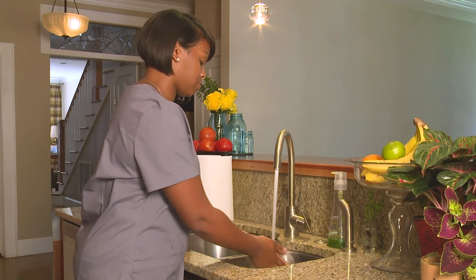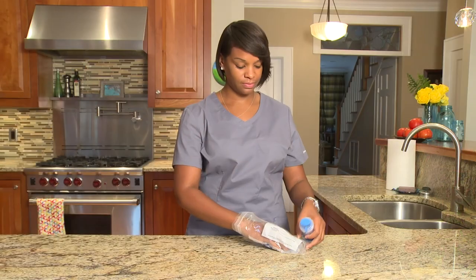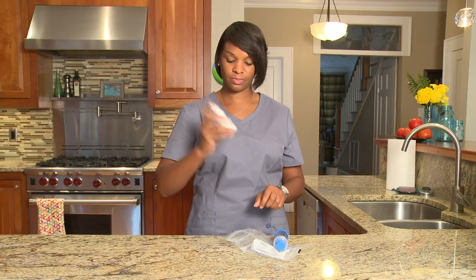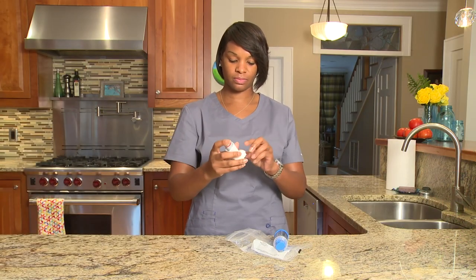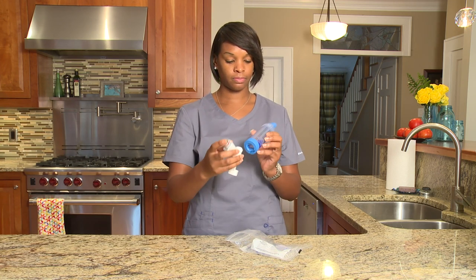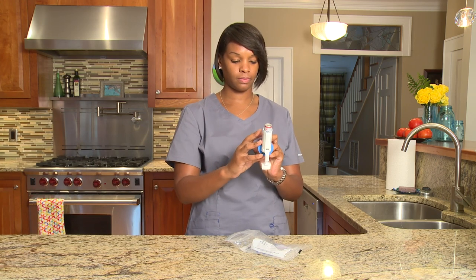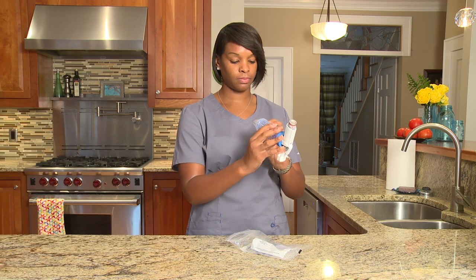It is important to wash your hands with warm soapy water and then dry them before using your MDI and spacer. It's also important to always shake the MDI before you use it. Then remove the MDI cap. Next, connect the MDI to the spacer by putting the MDI mouthpiece into the adapter and take off the spacer mouthpiece cap.